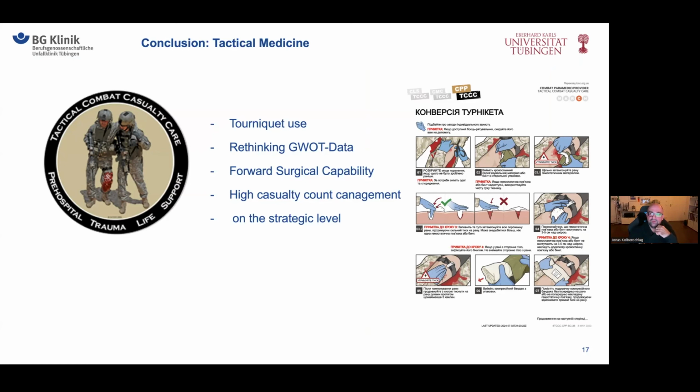So we have another question from our audience. What are the solutions for pediatric amputees? Any osseointegrative approaches? There is no solution in the pediatric field, because the growth area of the bones must be closed, and young age, before 21 years, is a contraindication for osseointegration.